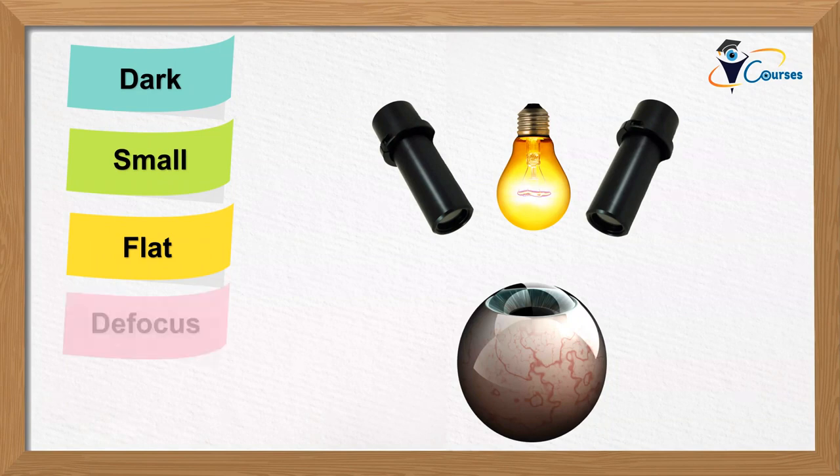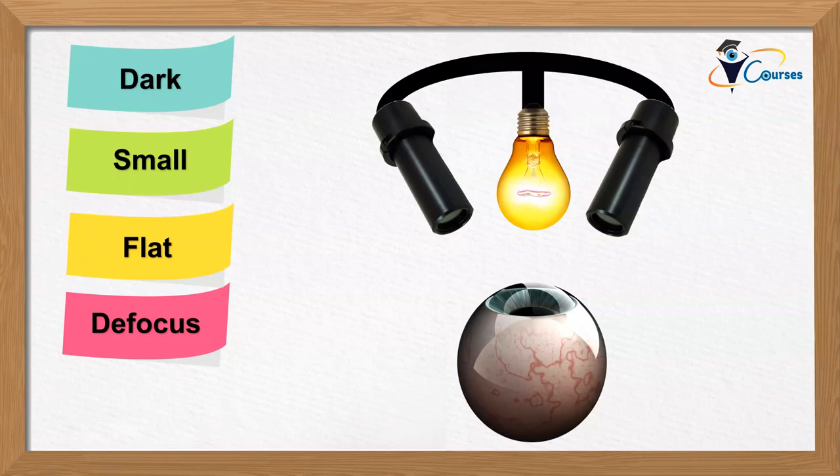Okay, what else? Another problem is defocus. If the light is focused at one area in the cornea, the microscopes can be focused on the iris, and vice versa. If the microscopes are focused on the cornea, then the light will be focused on the iris. So how can we make both the light and the microscope have the same focus? We put them on the same mechanical system, so that each time, the focus of the light will be the same as the focus of the microscope.